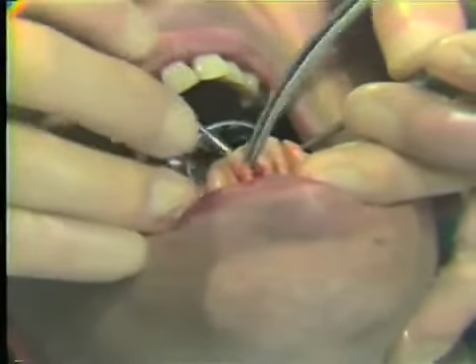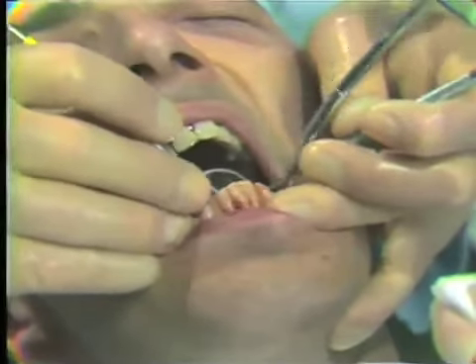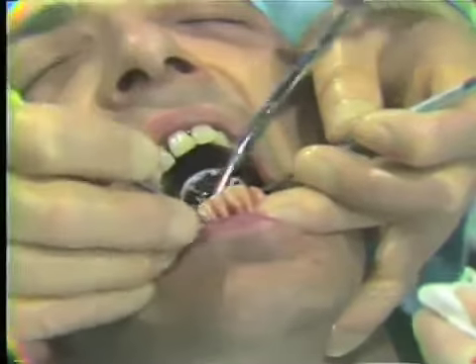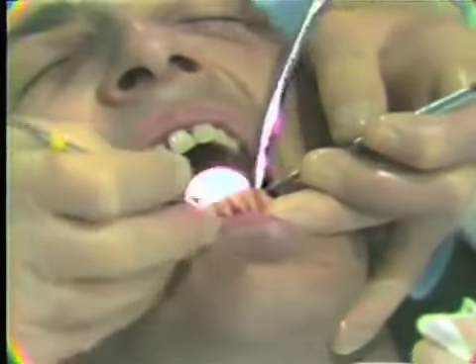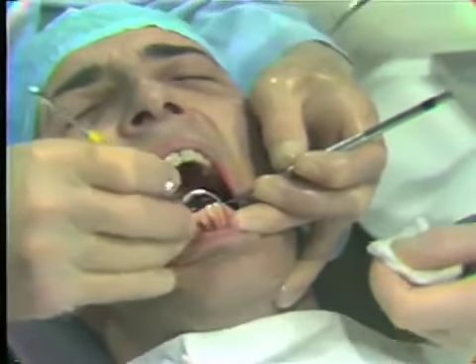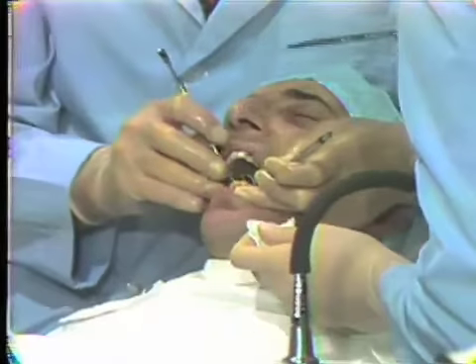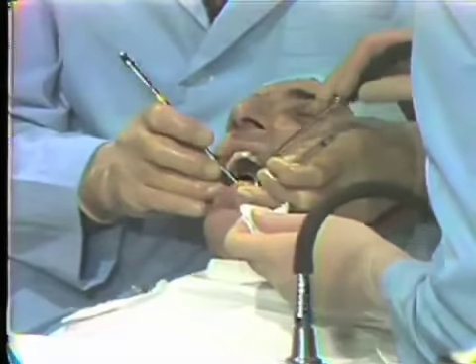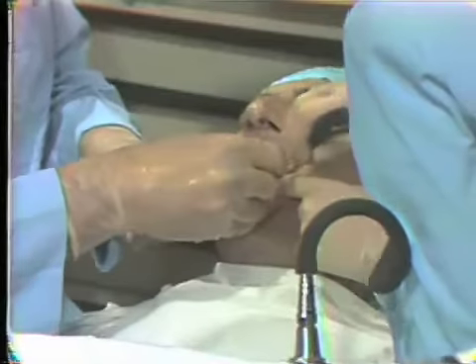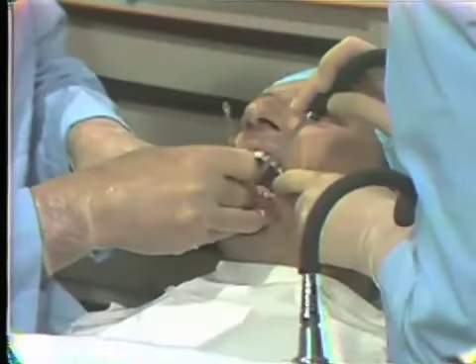You will note that she uses the aspirator in a manner where the tissue is not continually sucked into the aspirator tip. Ideally, we'd like to use the aspirator in a manner that moves it along sideways in the area rather than in a straightforward or punch-like manner, so that the tissue is not picked up and sucked into the aspirator, where it certainly causes more trauma to the papilla and to the gingival areas.